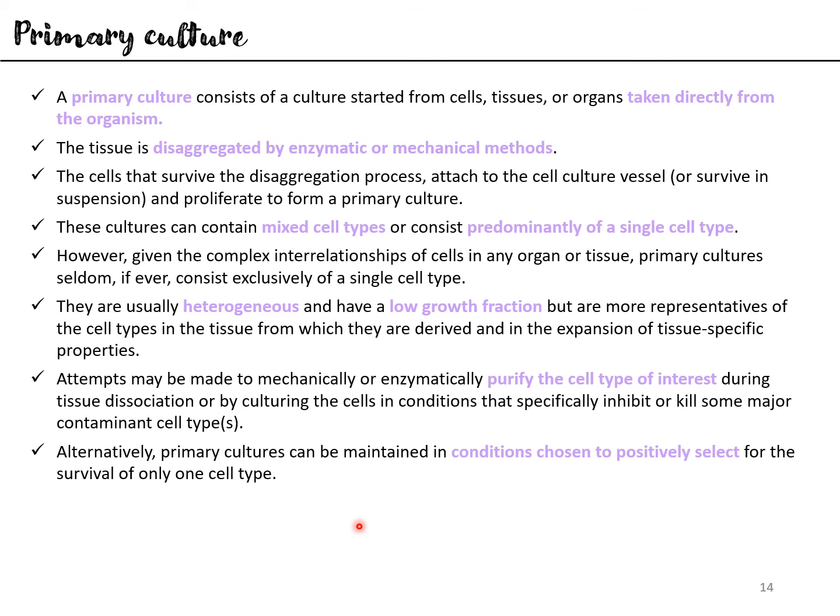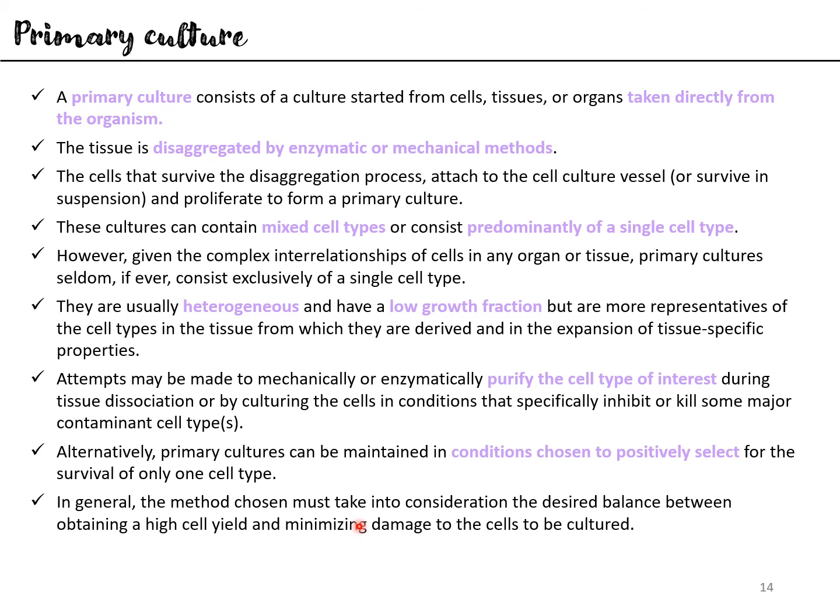So in this way also these other cells will die, but your aim is to promote better survival of your cells of interest, not killing the cells of non-interest.